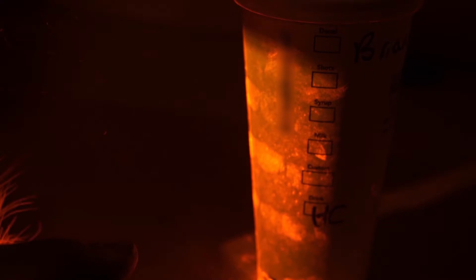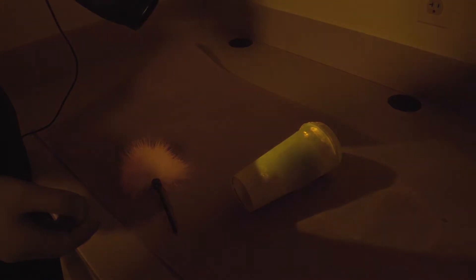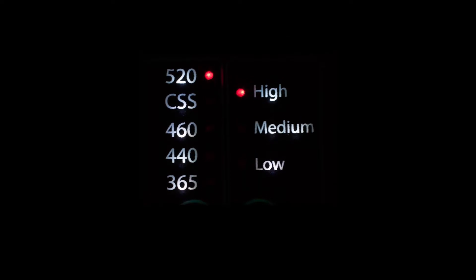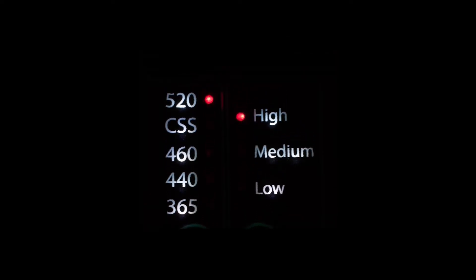It's no longer necessary to change components or have multiple lights nearby. With a touch of a button, wavelengths and power settings can be adjusted. Plus, with the backlit display, wavelengths and power selection at a scene or darkened lab can easily be managed.